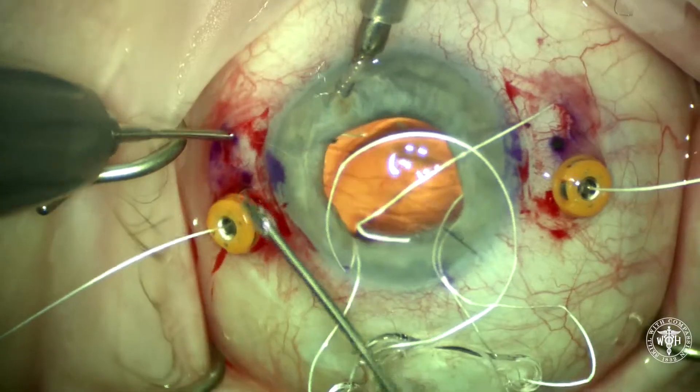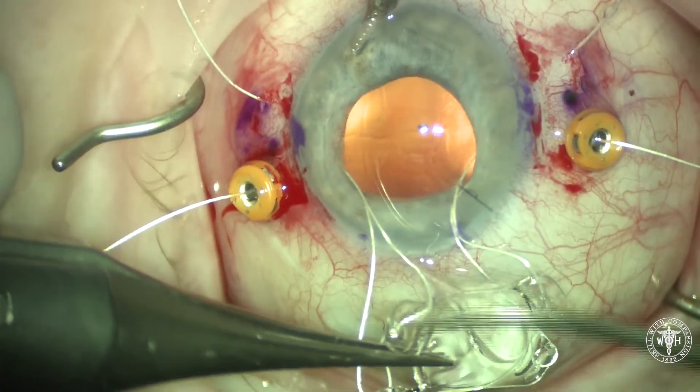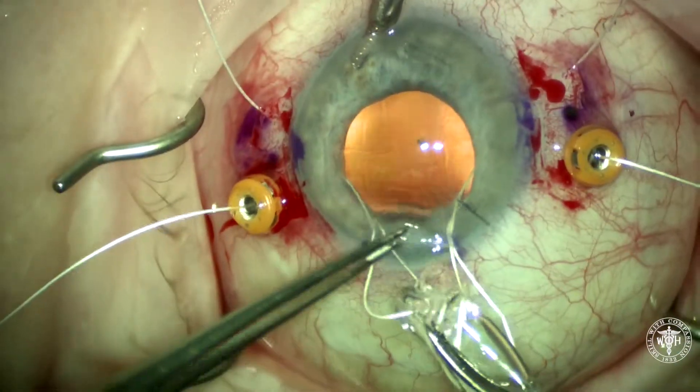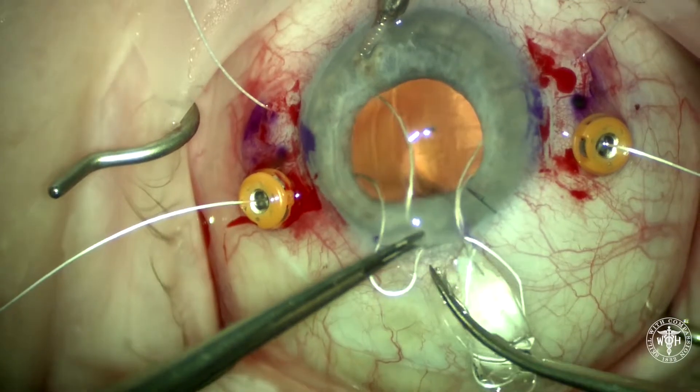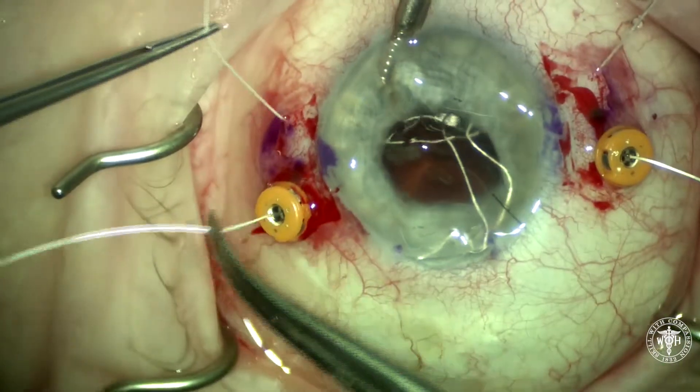There we are grabbing the second suture in the anterior segment and externalizing it through the sclerotomy. You can now fold the A060 IOL — I'm just using forceps to do that — through approximately a 4mm wound, and this IOL is going to go in pretty easily.